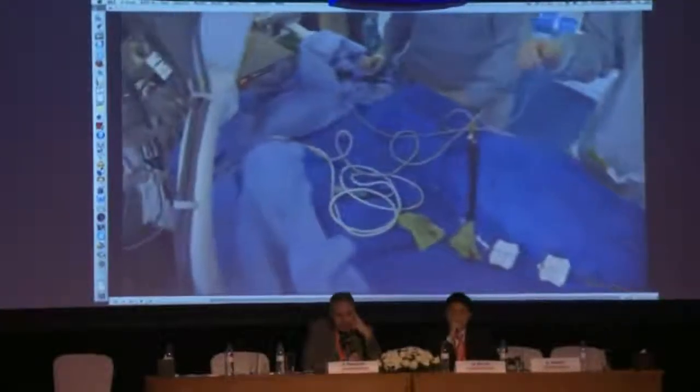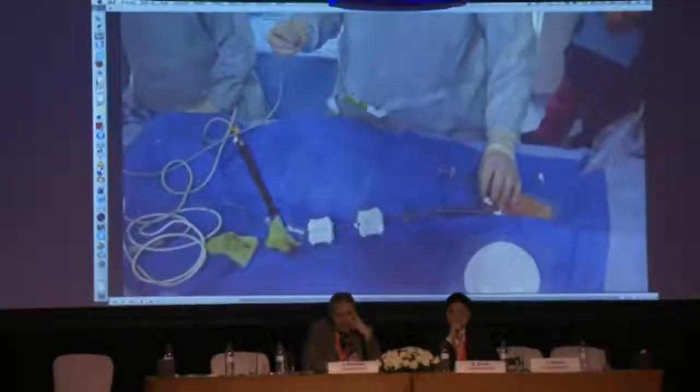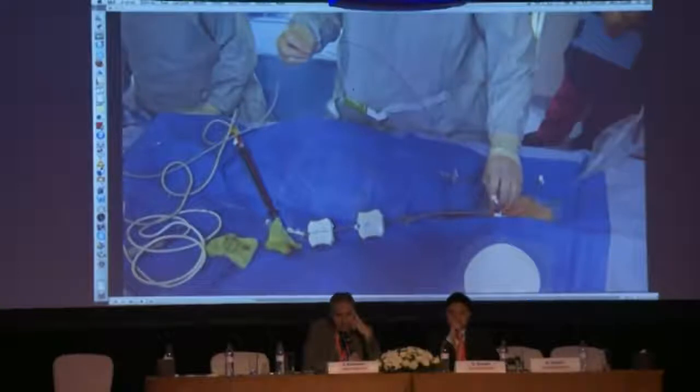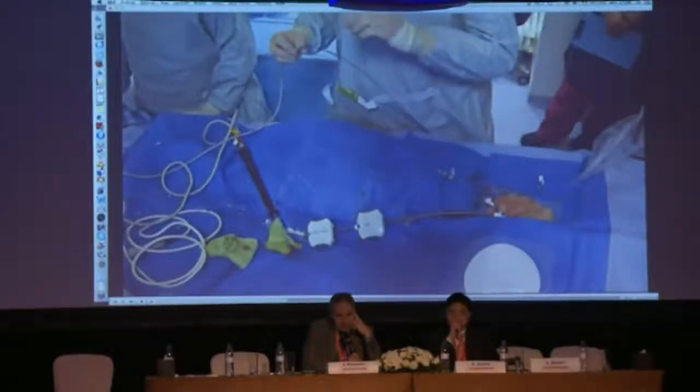We're then putting our decapolar catheter up. You can see me manipulating it there. And what we're really going to be seeing is the CARTO view. So if we can just skip forward a bit. Now, please, Fred, skip forward to the CARTO where we're recording the CARTO images.